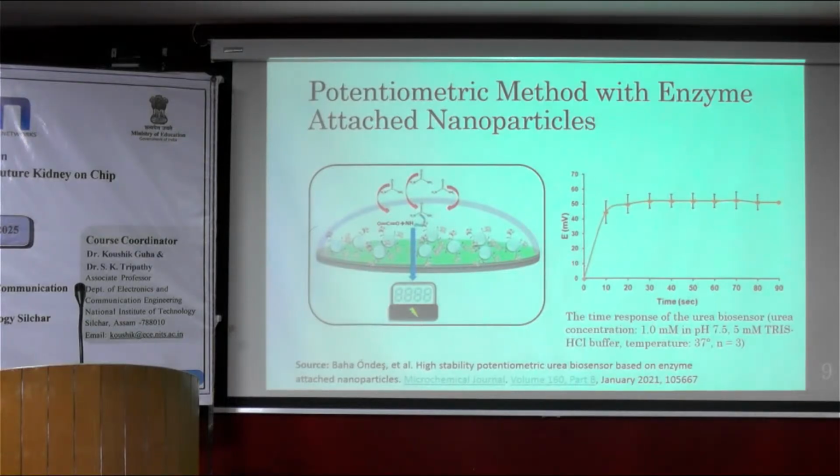So when we talk about the enzymatic method, we have to emphasize that we apply this method to something else. It could be a photosensor, or a working electrode if we're talking about the potentiometric method, or a 3-electrode system if we talk about cyclic voltammetry.